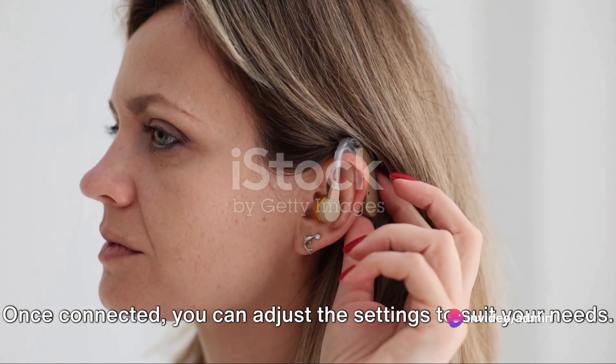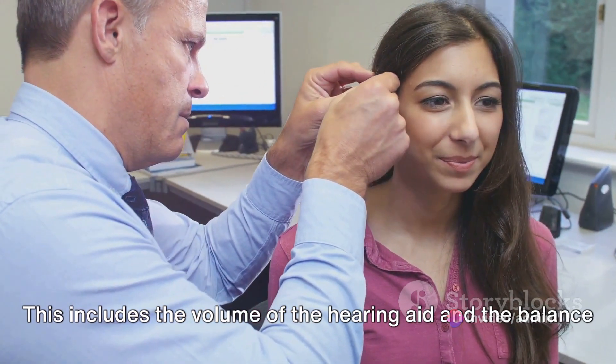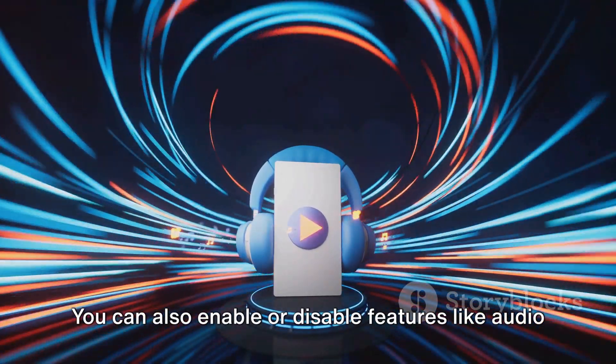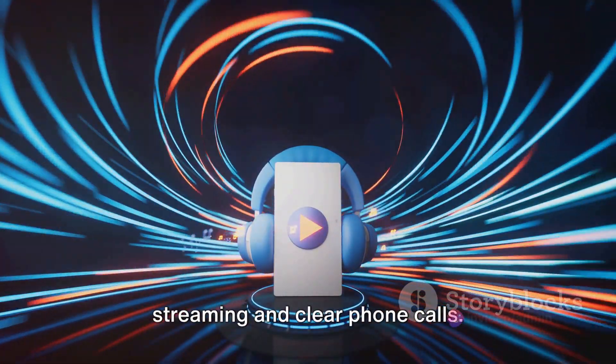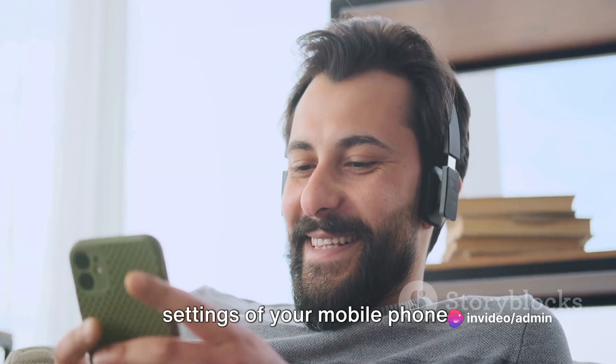Once connected, you can adjust the settings to suit your needs. This includes the volume of the hearing aid and the balance between the hearing aid and the ambient noise. You can also enable or disable features like audio streaming and clear phone calls. All these settings are usually found in the Bluetooth settings of your mobile phone.